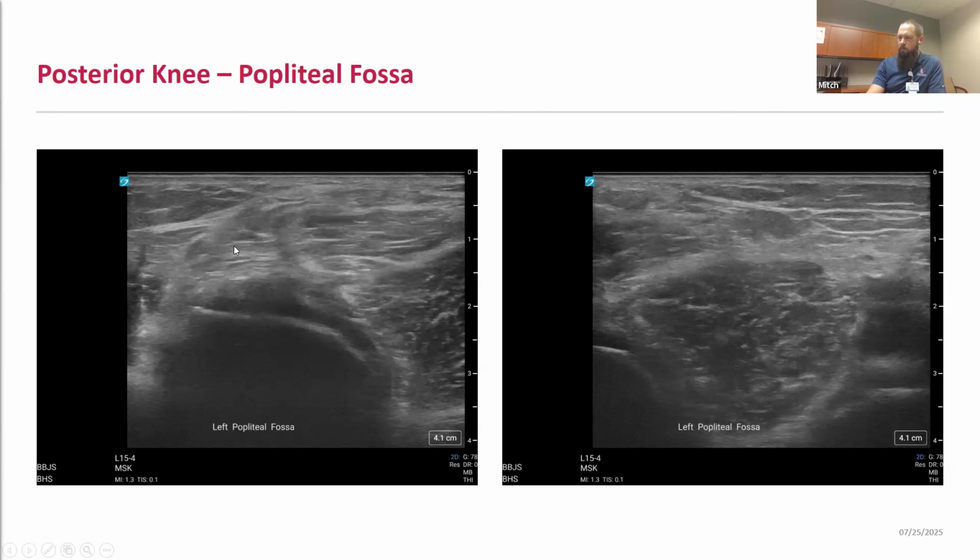And so this area is important to evaluate because this is where you're going to identify Baker's cyst if present, which you'll see fluid extending underneath the medial gastroc, and then that fluid gets pushed through the medial gastroc and the semimembranosus, which acts as a one-way valve, and then you will often get collection of bursal fluid present here as a result. And so this is the anatomy that you'll be looking for at the posterior medial knee in evaluating for a Baker's cyst.